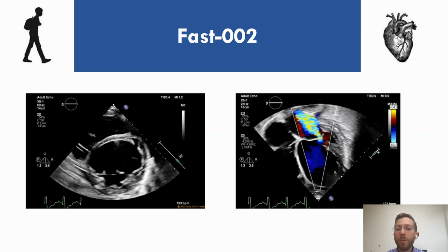And for those of you who may be interested in the imaging of this patient's heart, this is what his echocardiography looked like when he arrived at Stanford. So this is a cross-section of the heart. And when we look at the left image here, the crescent-shaped black patch above is going to be the right ventricle.